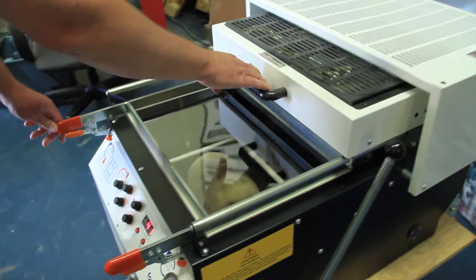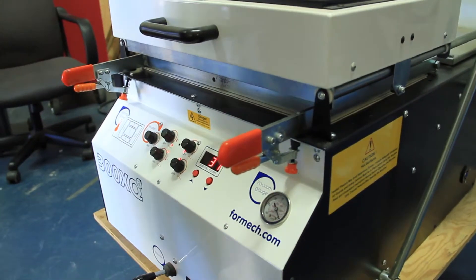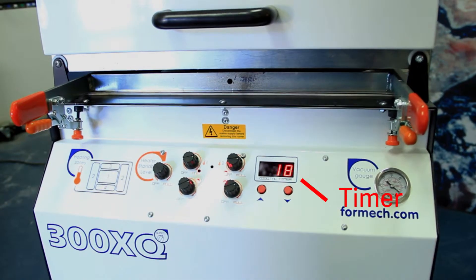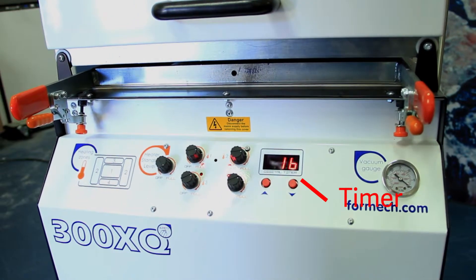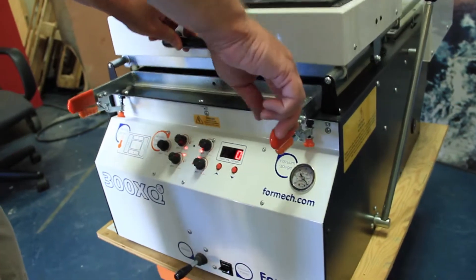Once the plastic has been fastened, slide the heater toward you over the piece of plastic. Once the heater has been secured, the timer will immediately begin to count down from the adjusted cycle time of the plastic being used. At zero, the machine will then beep and the heater must be removed.